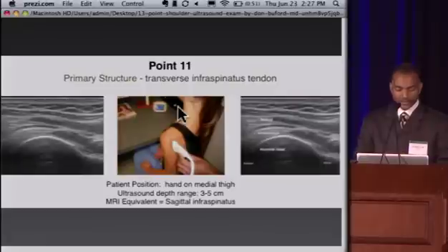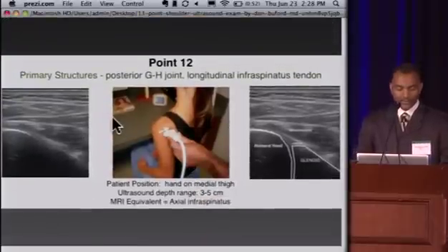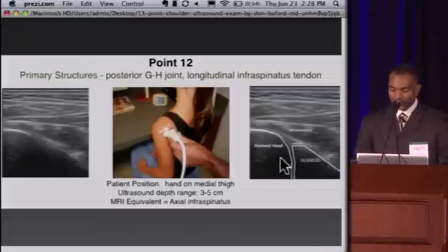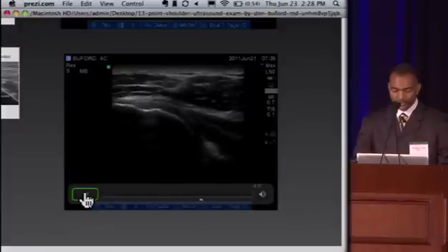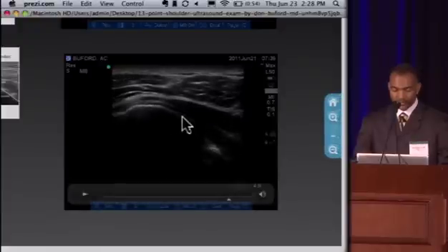At point 11, we turn the transducer 90 degrees to see the infraspinatus on its sagittal axis — superior on one side, inferior on the other — and we look for hypoechoic defects in the tendon. Point 12 was added for the importance of doing intra-articular injections and visualizing the needle entering the joint. We turn the transducer back transversely across the posterior shoulder and slide it medially to get a view of the glenohumeral joint. The labrum appears as a hyperechoic triangular structure off the glenoid, the humeral head is adjacent, and the infraspinatus comes across turning into muscle as we go medially.